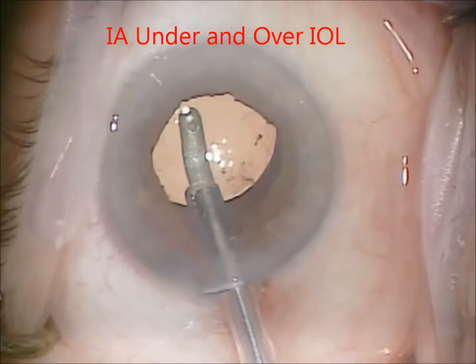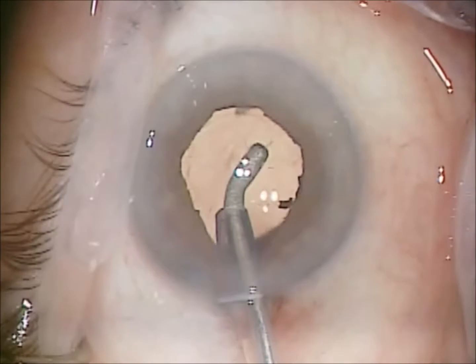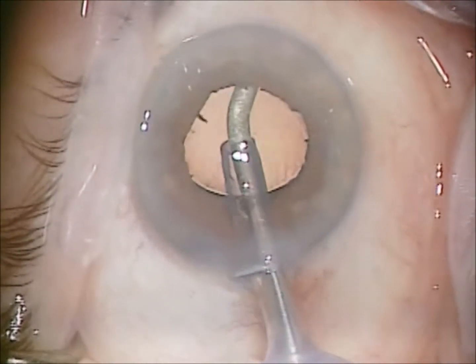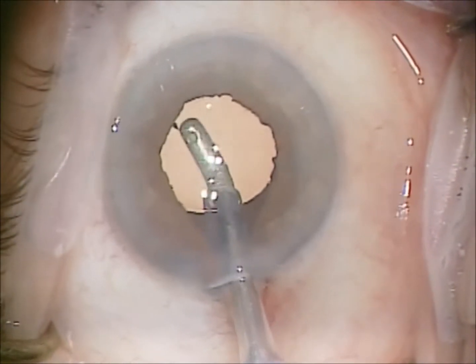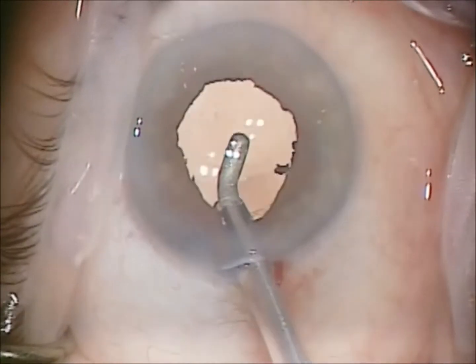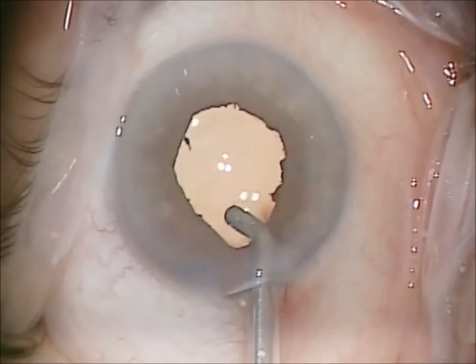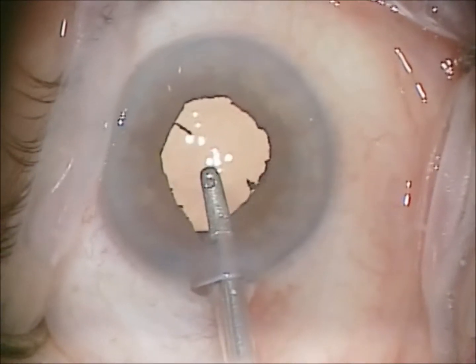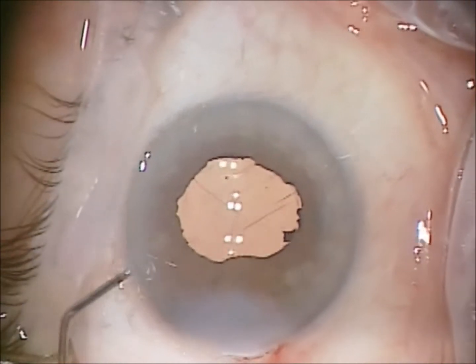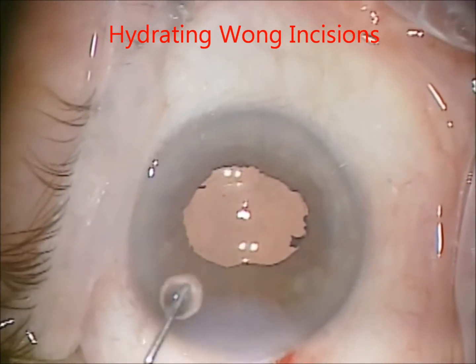I perform irrigation aspiration for viscoelastic removal under the lens and over the lens. Found a little extra piece of cortex there. Lens looks well positioned. I'll hydrate the wounds — these are long tunnel-type incisions, so I hydrate along over the main incision and the paracentesis, and finish the surgery.